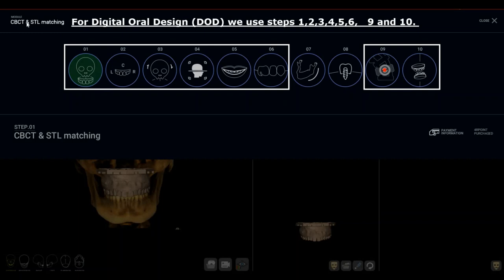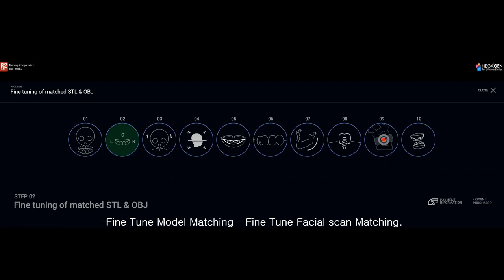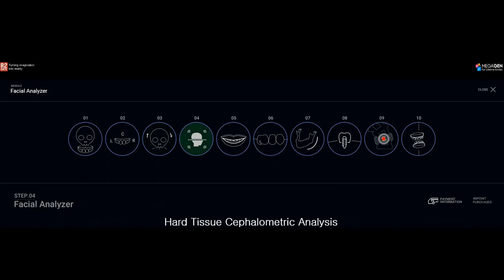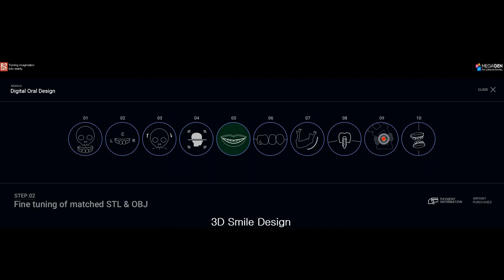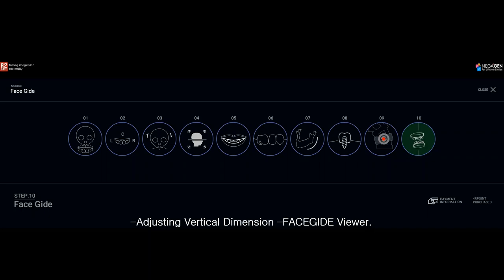As mentioned in the previous video, to use Digital Oral Design we use steps 1, 2, 3, 4, 5, 6, 9, and 10. Step 1: model matching and facial scan matching. Step 2: fine-tune the model and facial scan matching. Step 3: CBCT Reorientation, Digital Face Bow, Digital Occlusal Plane, and Soft Tissue Cephalometric Analysis. Step 4: Hard Tissue Cephalometric Analysis. Step 5: Three Dimensional Smile Design. Step 6: Wax Up Design. Step 9: Quick Guide and Digital Mounting. Step 10: Adjusting and Altering the Vertical Dimension and Face Guide Viewer.